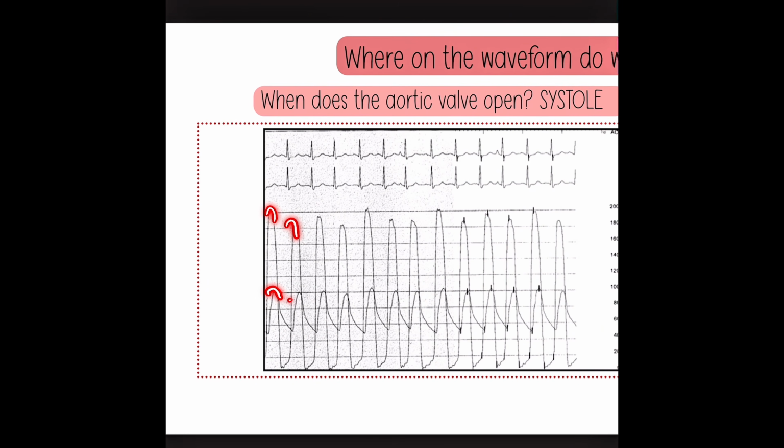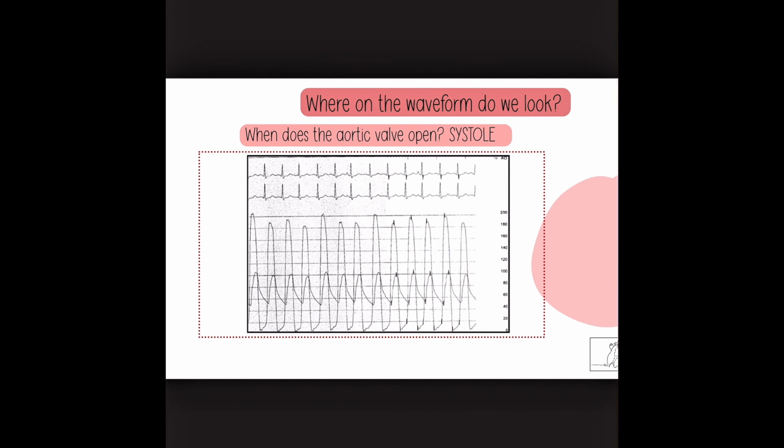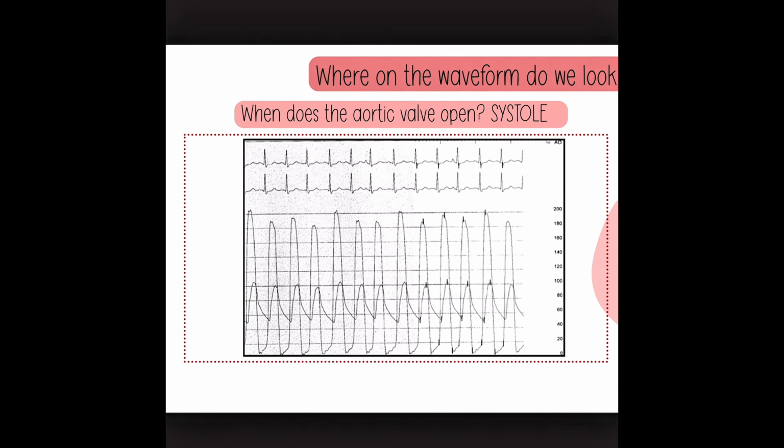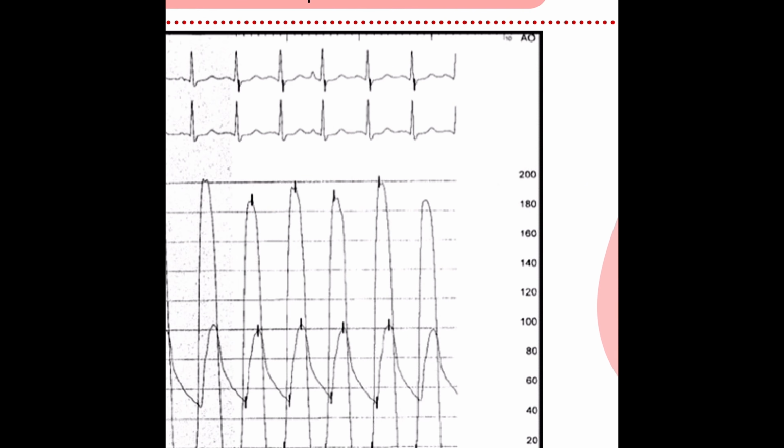We're going to look up here at the difference between the systolic peaks. So let's see if we can measure. Now this is simultaneous. Both of these are overlapped, happening at the same time. Where is, oh, it's all the way over here. So I'm just choosing these.